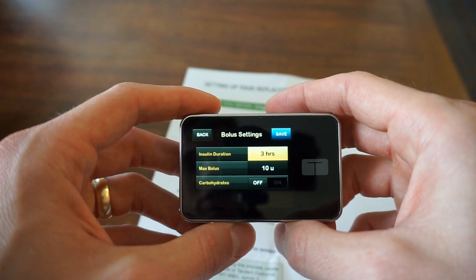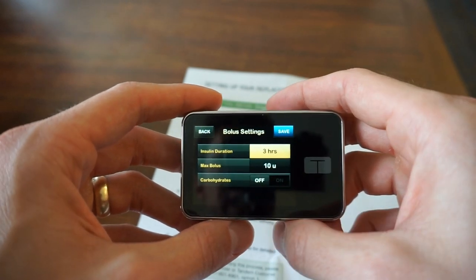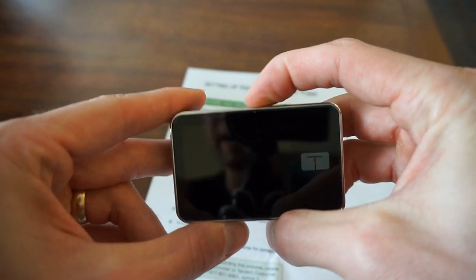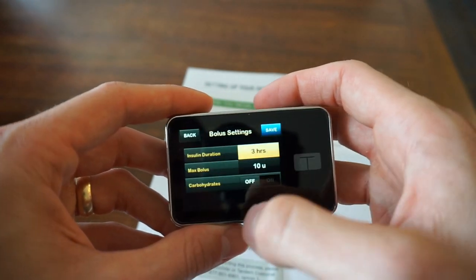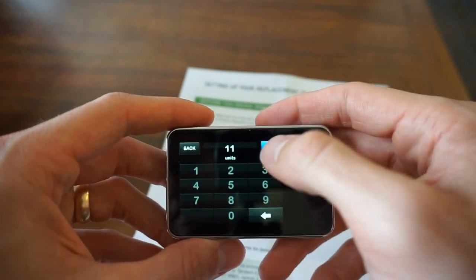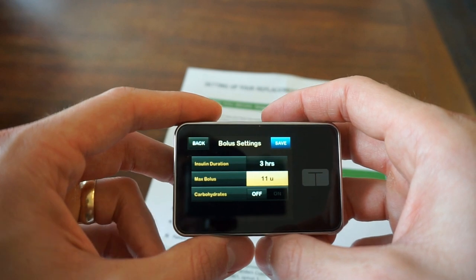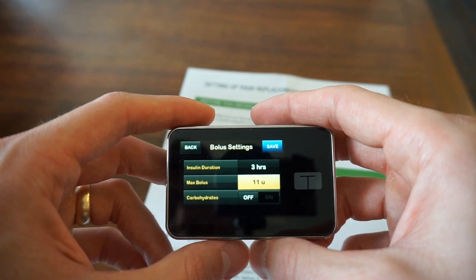Max Bolus is how much this pump will allow you to bolus at one period of time. So if I have it set at 10 and I'm eating a big meal that requires 11, it will notify me and say, hey, your max bolus is 10, we can't do that. My personal preference is to have it set at 11, because I never have more than 11 units on board — which I guess gives you an idea of my carb ratio; I eat a lot of carbs.